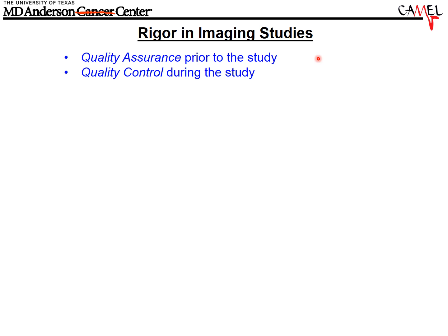You can think of other cases, a diffusion-weighted MRI. You might have a phantom, or you test the diffusion-weighted phantom and ensure that you're getting the right diffusion number before you actually start to study mice. However, I think what's underappreciated is that it's good to have quality control. And in the agriculture industry or the food industry, quality control is paramount. And samples are tested periodically to make sure that the entire crop or entire food line is safe, right?